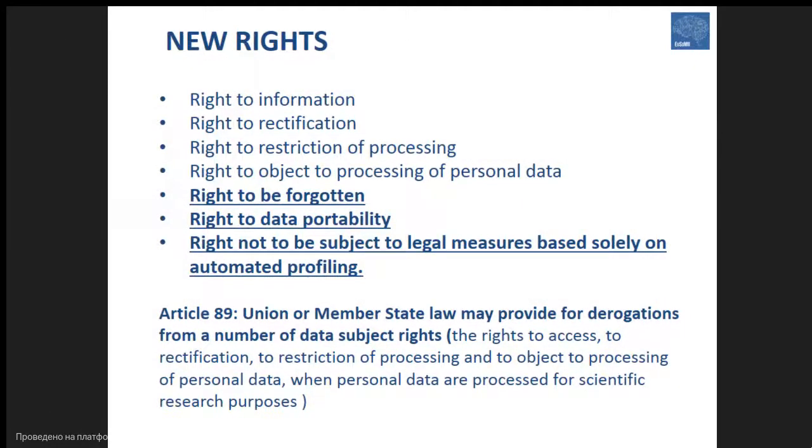EU citizens have received new rights, such as the right to be forgotten, which means that all of the data in PACS or in HIS might be deleted on patient request, the right for data portability, so to transfer the data from one hospital to another electronically in a standard format, and the right not to be subject to legal measures based solely on automated profiling.